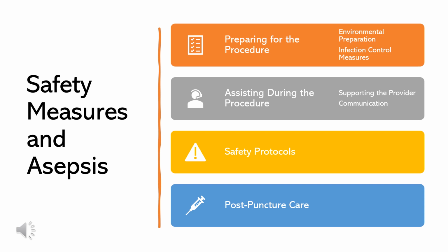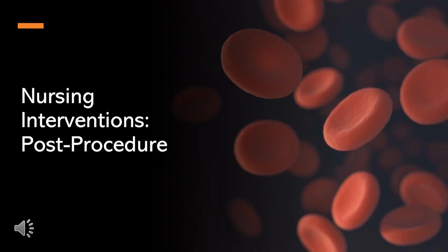Record the procedure's details such as time, healthcare provider, any complications or patient reactions. And remember, this documentation should also include the results of any pre-procedure tests like the Allen's test. Nursing interventions post-procedure.